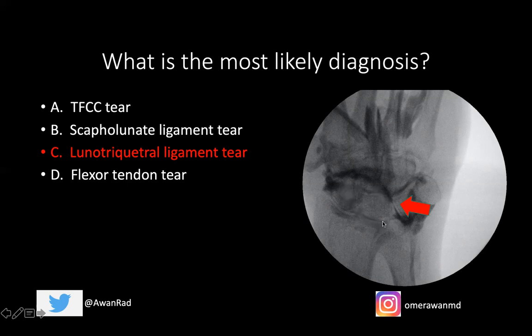A TFCC tear — the triangular fibrocartilaginous structure that runs between the radius and the ulna — would show contrast extravasating into the distal radioulnar joint. You would see contrast pooling right there in the distal radioulnar joint. We don't see contrast extravasating into the distal radioulnar joint, so we can infer that the TFCC is actually intact.